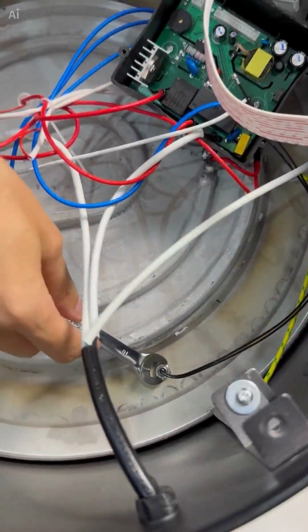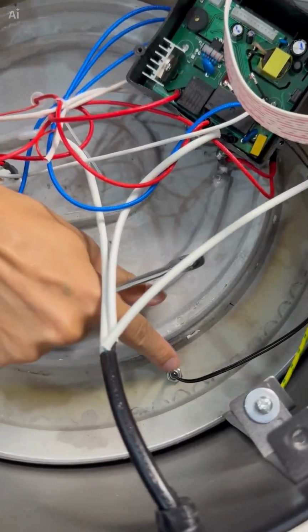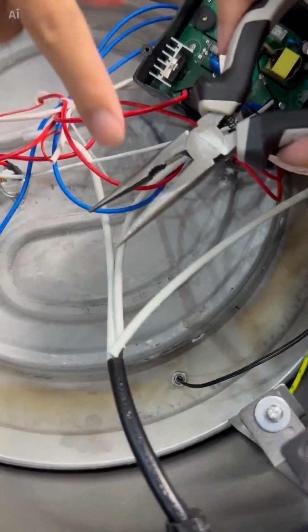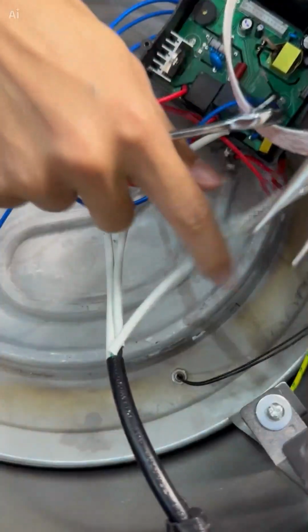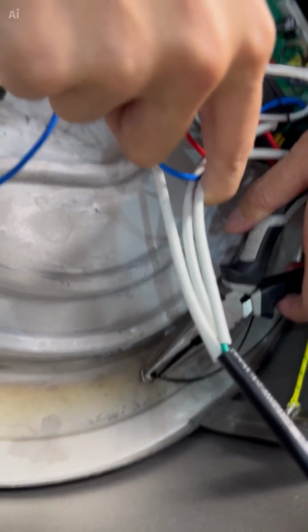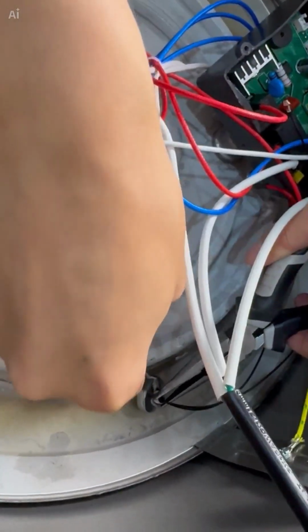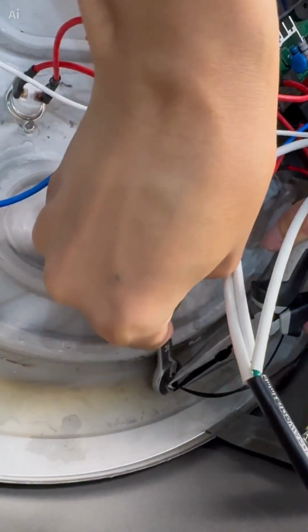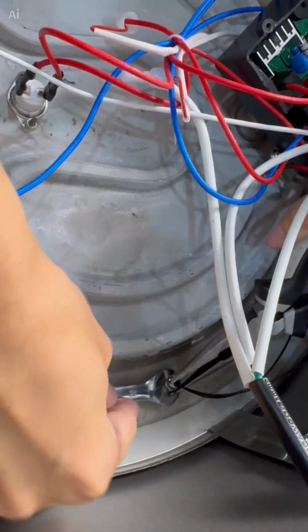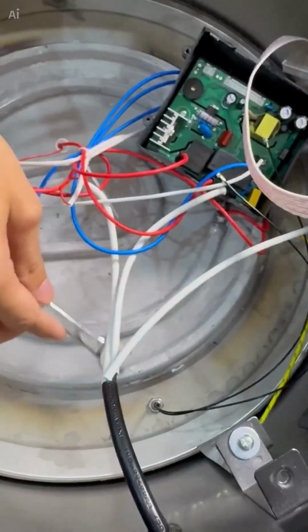If this nut cannot be tightened, and when you rotate this nut, the screw also moves and the temperature probe rotates with the nut, then we need to use pliers to help us tighten it. With the pliers, grip the screw of the temperature probe and use a hex wrench to turn the nut below like this. This way you can tighten the temperature probe.